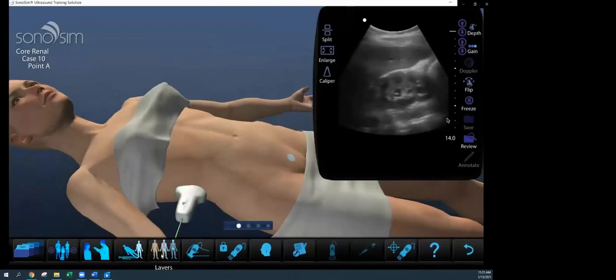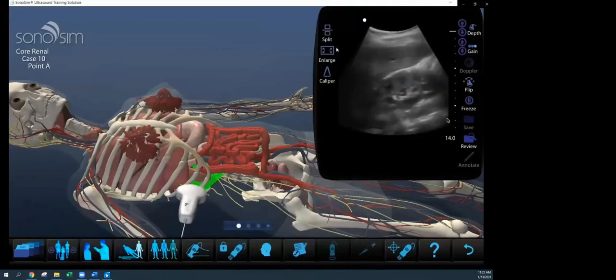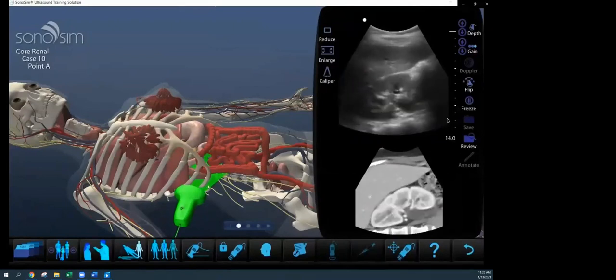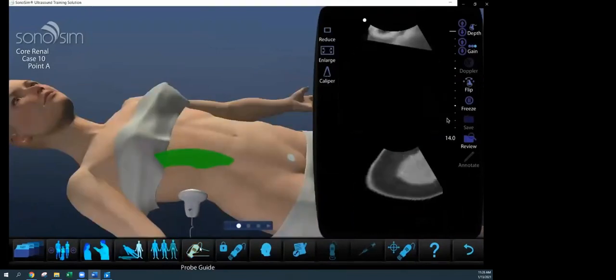And as I scan through, for learners, it's really important for them to have an appreciation. As you fan an ultrasound transducer through the body, you can see how a variety of different image slices translate to an ultrasound image. We also have a tool that, when it was relevant, patients underwent cross-sectional imaging. Here, the same patient underwent a CT scan. So the learner can understand how the probe and the transducer beam transects through the body, how it translates to an ultrasound image, and how that correlates with a CT scan image of a kidney with hydronephrosis, with a spine, with the liver and Morrison's pouch interposed between the two structures. So really valuable. As you're learning, you may not know, I'm going to put the probe in an unnatural position.